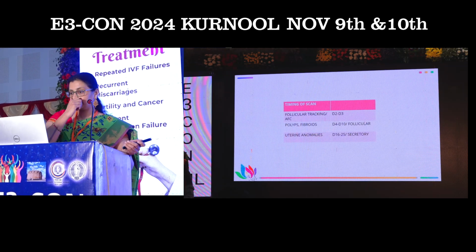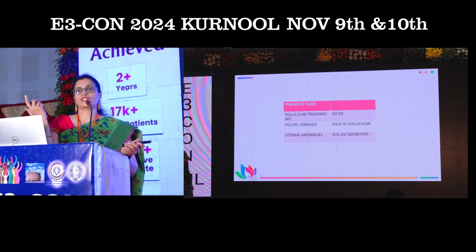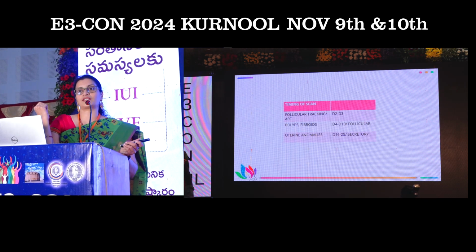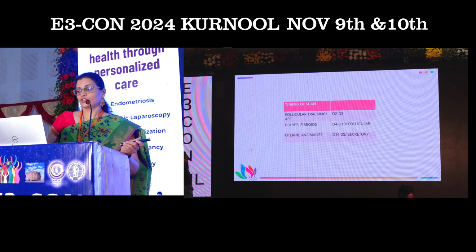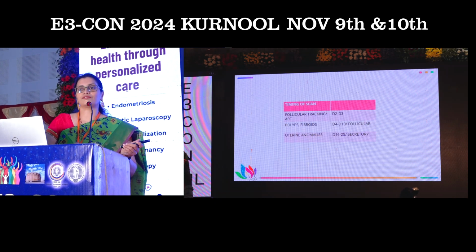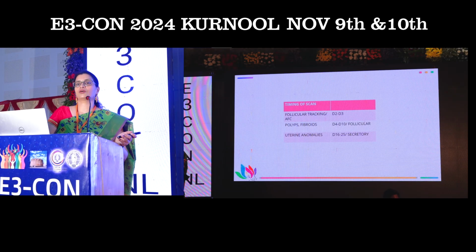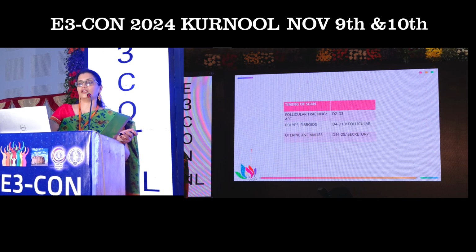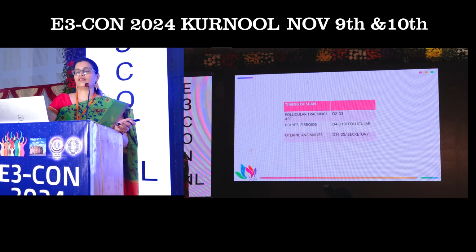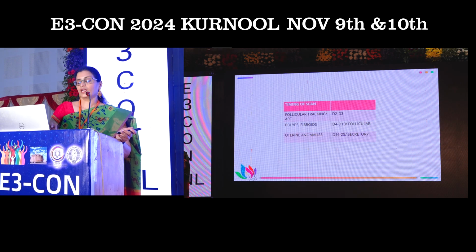So timing of a scan is also important to get the maximum out of our vaginal ultrasound examination. We all know follicular tracking, we do usually, the patients are referred at around 9 to 10 days when we expect the dominant follicle to grow. But it is best practice to start your follicular tracking with a baseline scan on day 2 or day 3, where we have an idea of the ovarian reserve and also we can plan the appropriate stimulation.